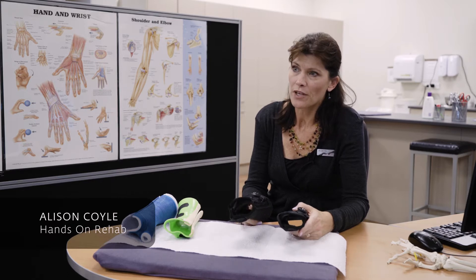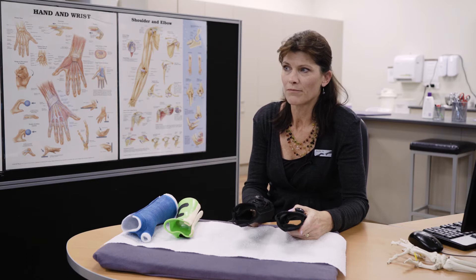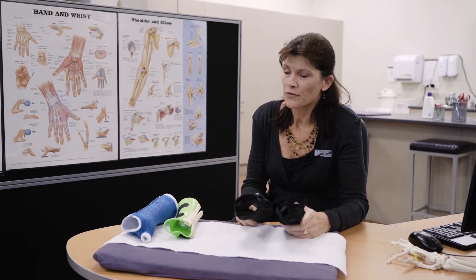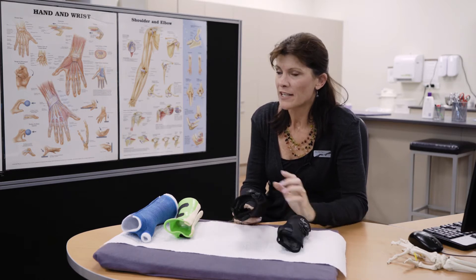If you've been referred to us with a wrist sprain or wrist pain that's continuing longer than you would have hoped, there are a few products that we would use preferentially, particularly these exhaust braces.